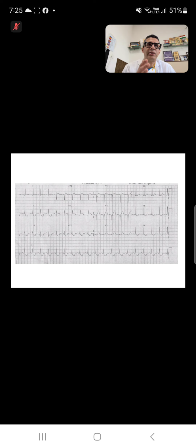Your mind should run through rhythm, axis, P wave, PR interval, QRS complex, ST segment, T wave, QT interval. It should come to your mind the moment you see the ECG; you have to go through that. Unless you practice, you saw how difficult it was that after the P wave suddenly you jump to ST, then again come back. So unless you practice, you are not going to achieve perfection in reading the ECG. So you should repeatedly do that.